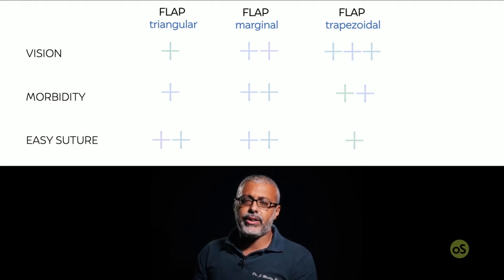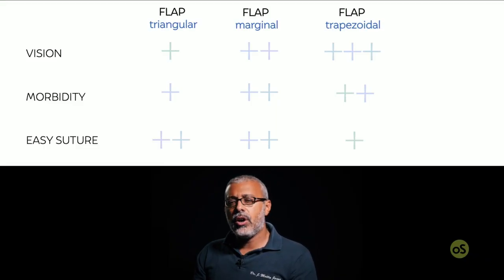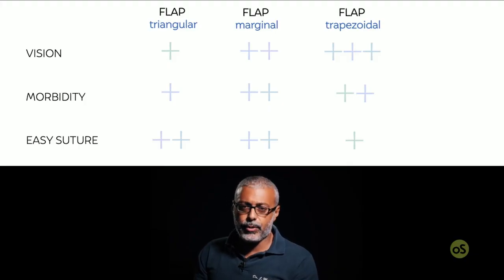And also for the ease of suture, the fact that we don't perform two releasing incisions in the triangular flap makes it easier to suture at the end of the surgery in comparison to the trapezoidal flap.